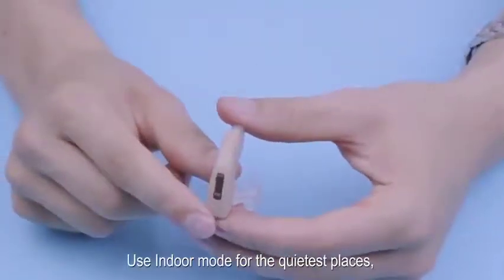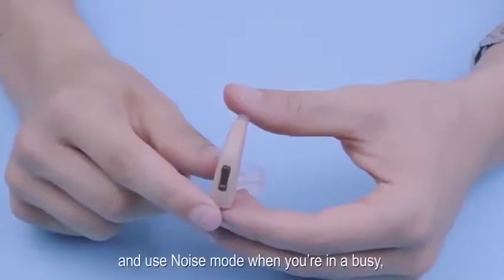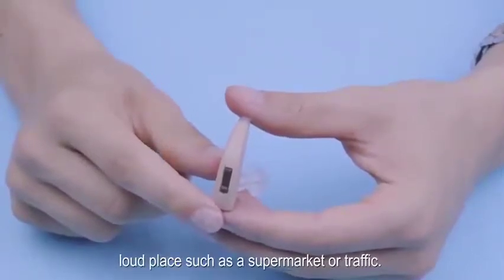Use indoor mode for the quietest places, for example when you are reading a book. Use outdoor mode when outside, and use noise mode when you are in a busy, loud place such as a supermarket or in traffic.